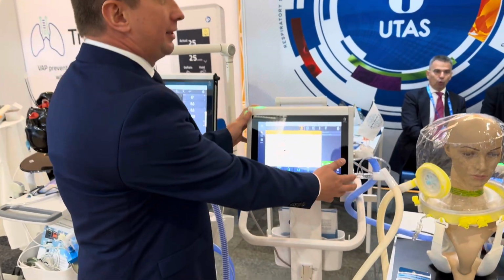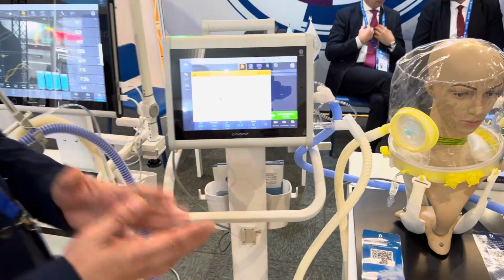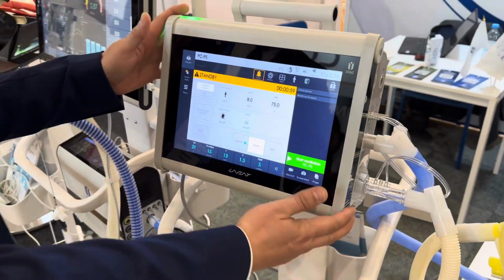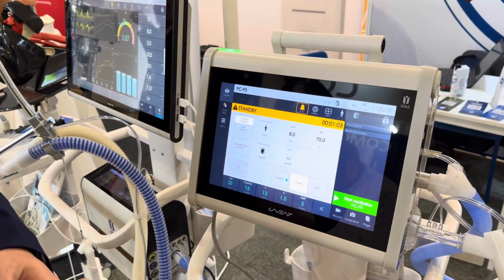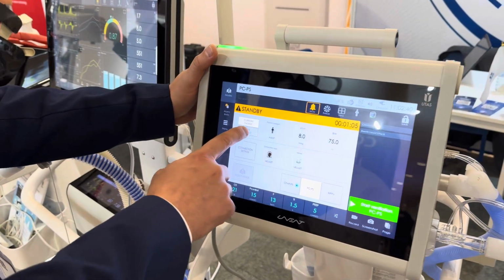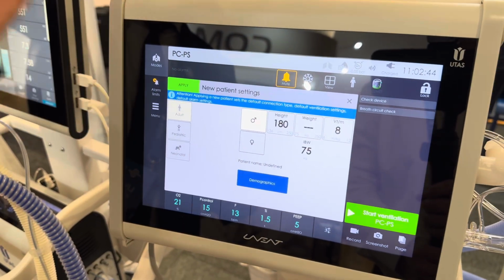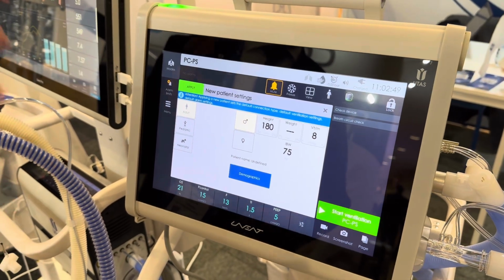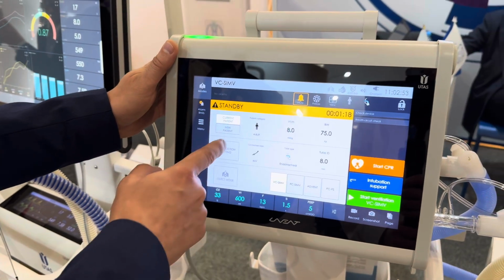This is a compact size expert class machine which is intended for intensive care, invasive and non-invasive ventilation in the hospital, for in-hospital transportation, and also in ambulance. The device is designed for all ages of patients, for neonatal, pediatric, and adults. It has a tidal volume range that starts from 2 ml up to 4 liters. It's designed for invasive and non-invasive ventilation.